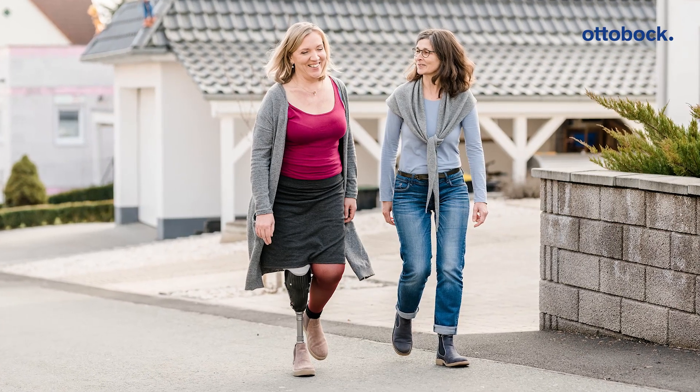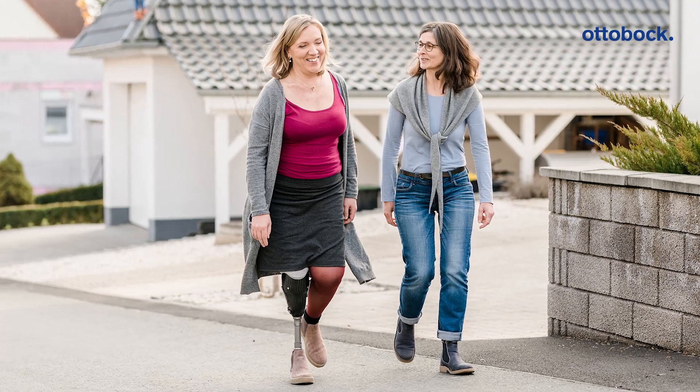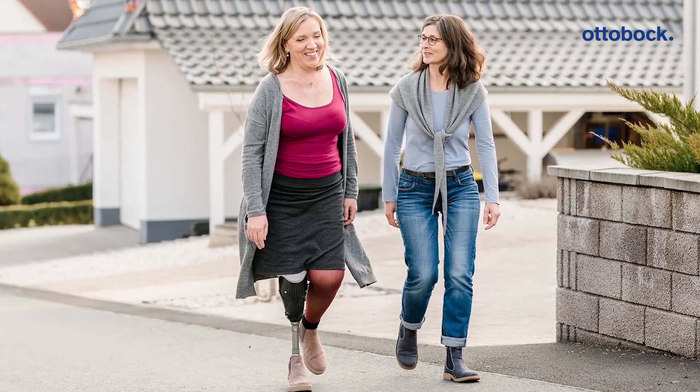With secure, controlled movements, the Triaz adapts to varying terrain and ensures stability and security in every step.